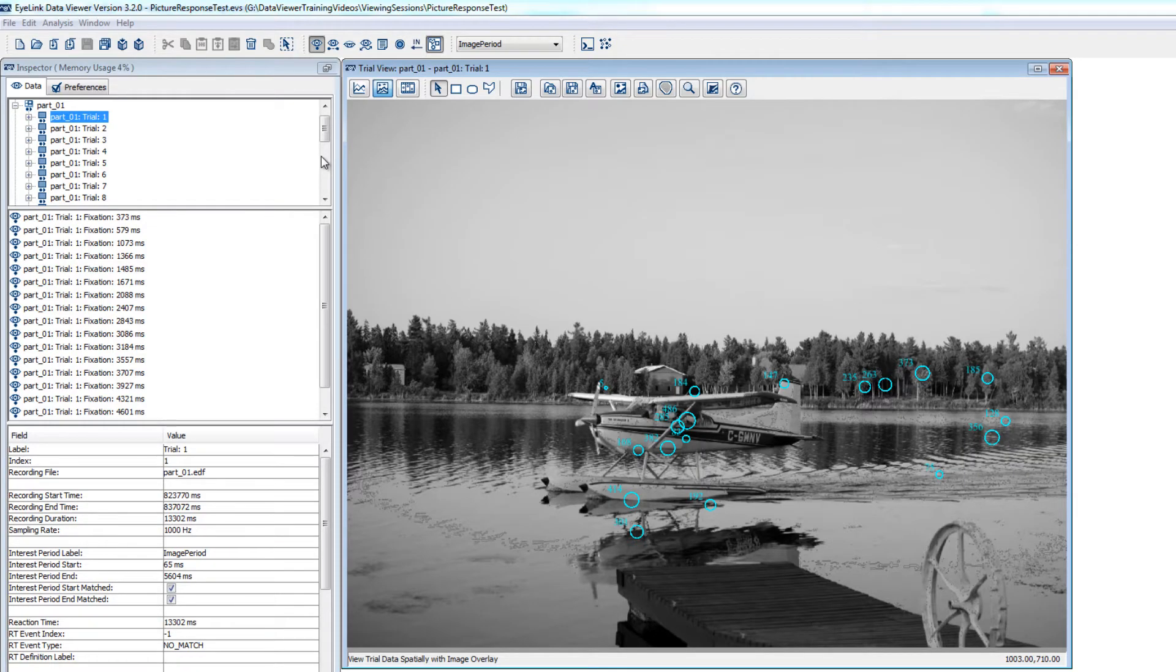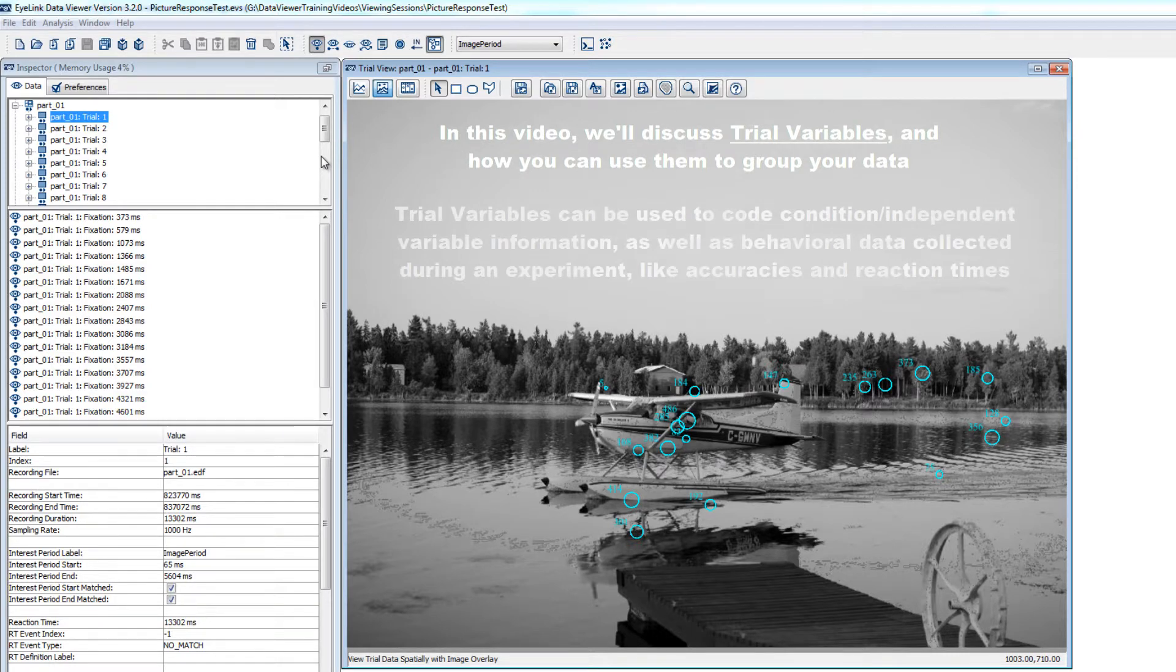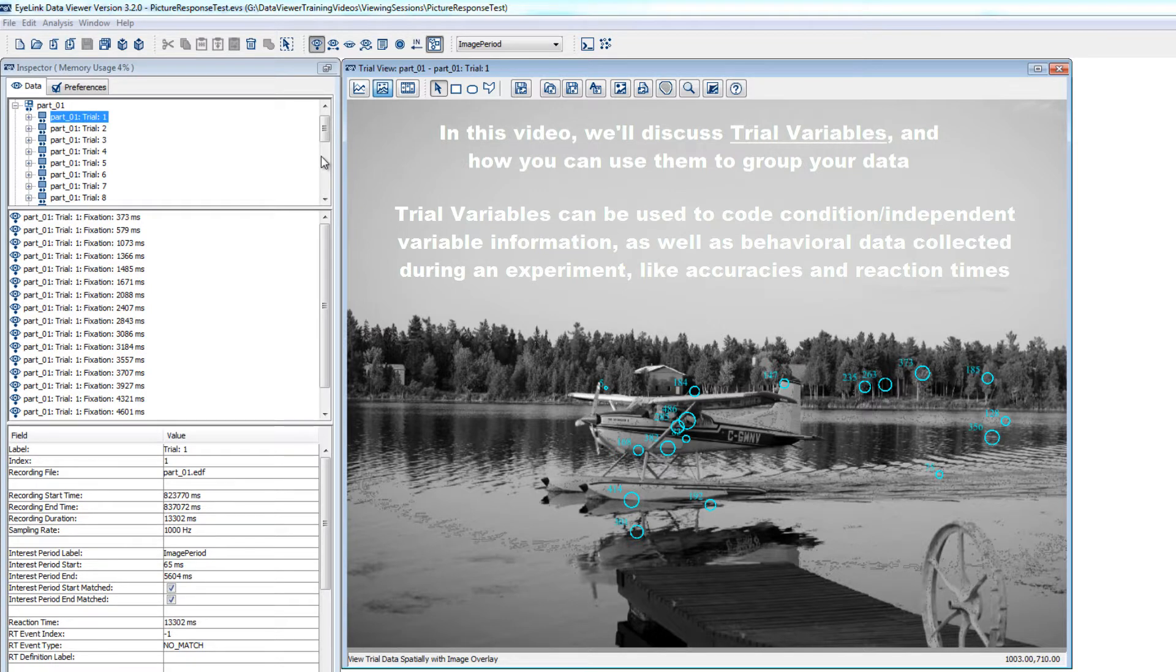A central organizing principle in Data Viewer involves the use of trial variables. Trial variables in Data Viewer usually come from your experimental script and are typically set up to code condition or independent variable information and information about any dependent measures that were collected in addition to the eye tracking data.